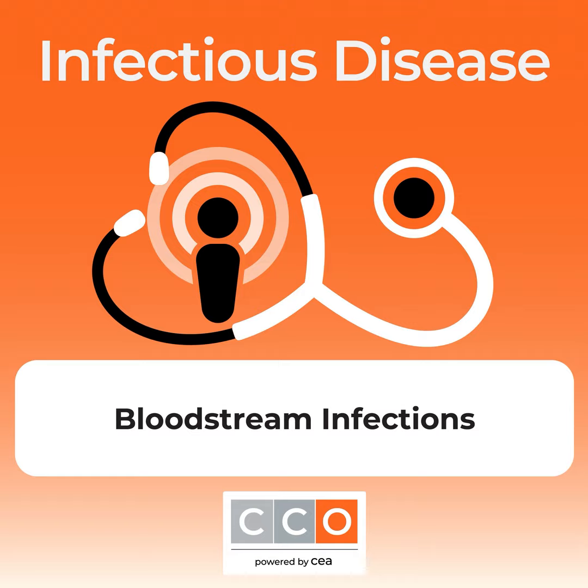Blood cultures are a gold standard for diagnosing bloodstream infections. And like many diagnostic tests, they need to be done well, or the results can actually cloud the clinical picture. You may hear people talking about getting good blood cultures. When we're talking about getting good blood cultures, we're generally referring to adequate aseptic technique and adequate volume. Having enough blood is a major determinant of blood culture sensitivity.